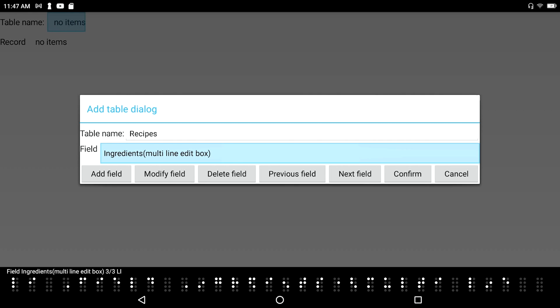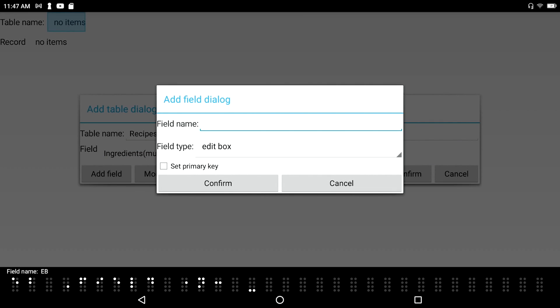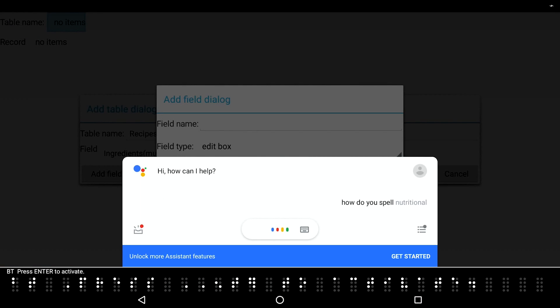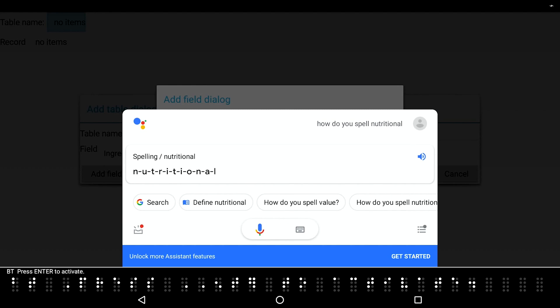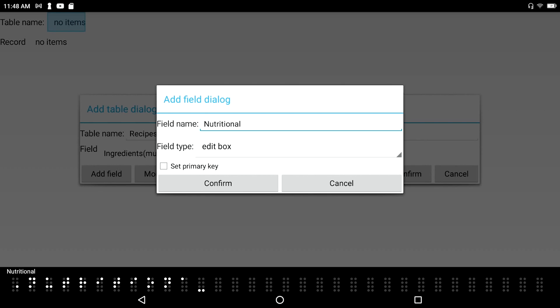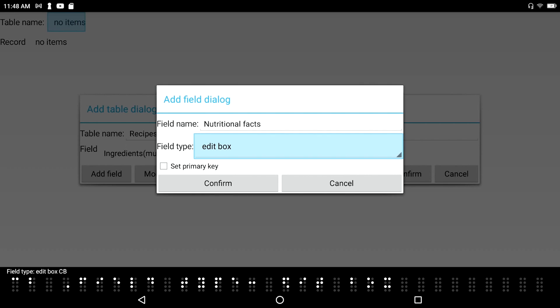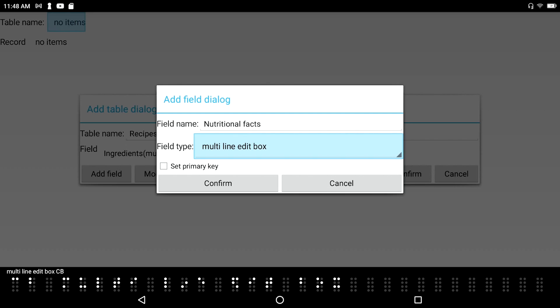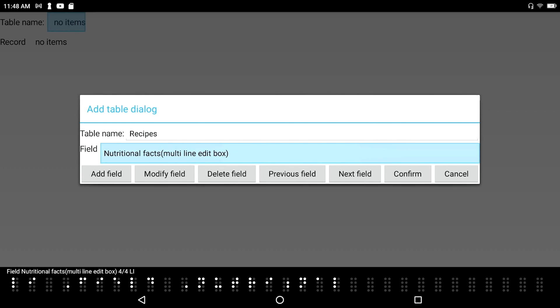Let's do another one called 'Nutritional Facts.' I wasn't sure how to spell 'nutritional,' so I asked Google — 'nutritional is spelled N-U-T-R-I-T-I-O-N-A-L.' I press space-Z to exit the assistant, then type in 'nutritional facts.' For the field type, I again select multi-line edit box and press enter. New field added: field 'Nutritional Facts', multi-line edit box, 4 of 4 list item.